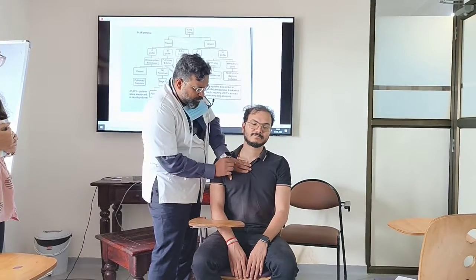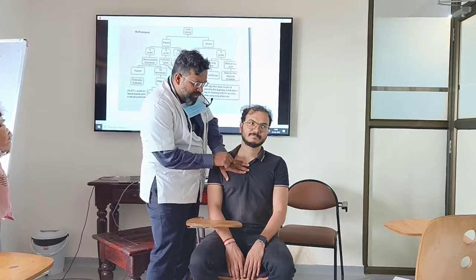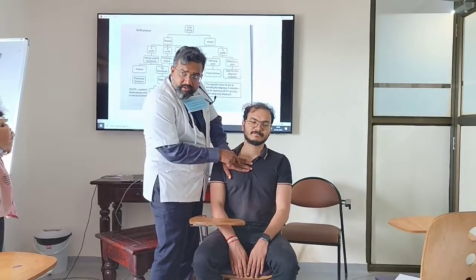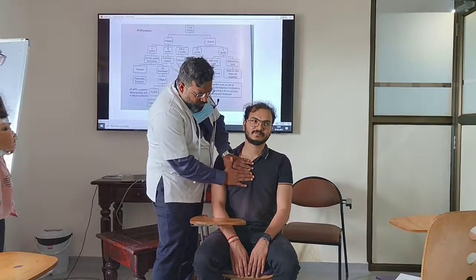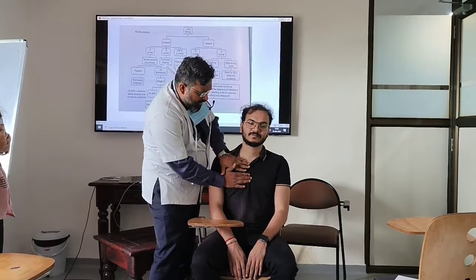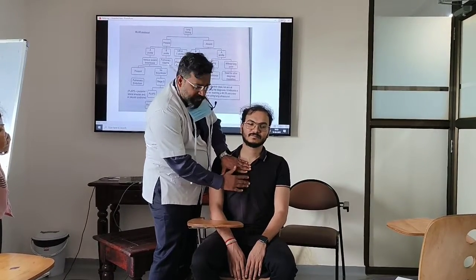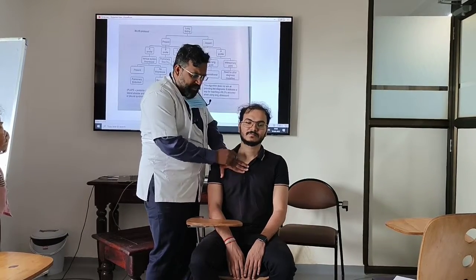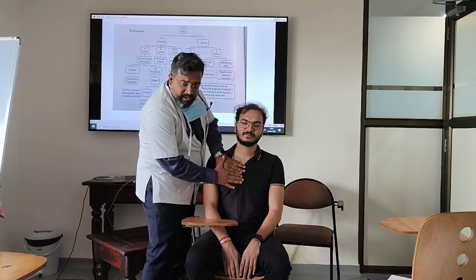In average hands, we get 2 points. The upper blue point in the center is somewhere between the middle finger and ring finger. The lower blue point is in the center of my palm. When I keep my fingers like this, my little finger is flush with the clavicle. My other fingers are kept right below this, and my thumbs are on top. Thumbs are not included in this particular image.